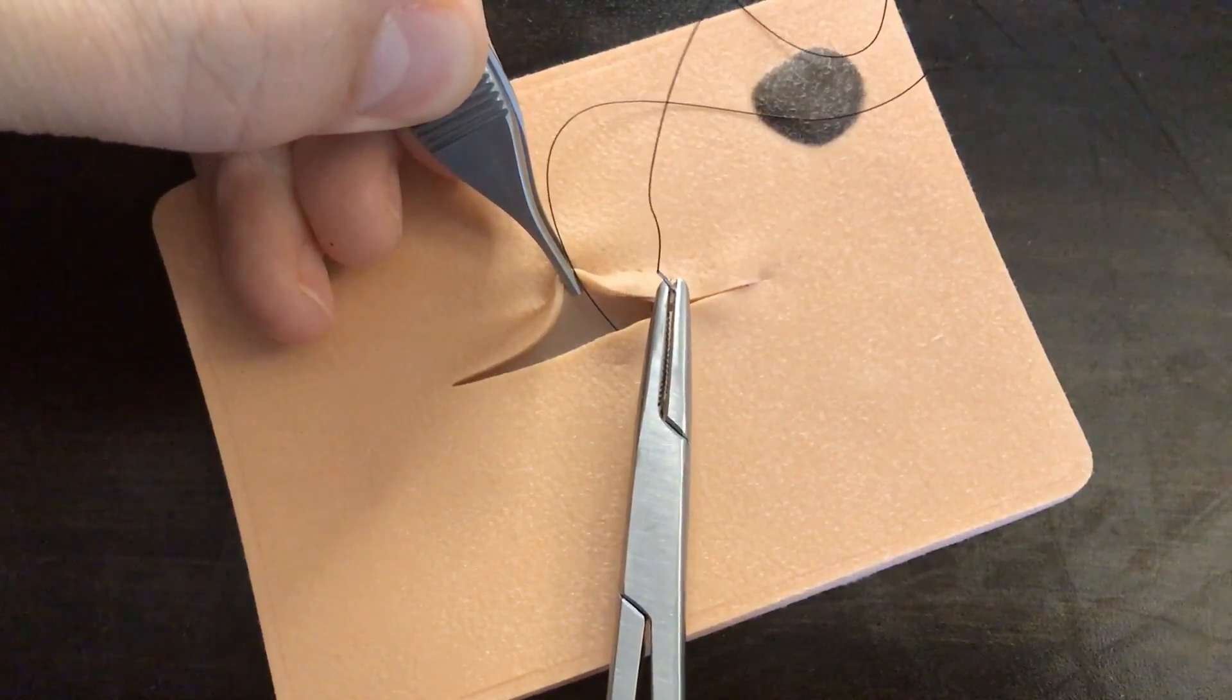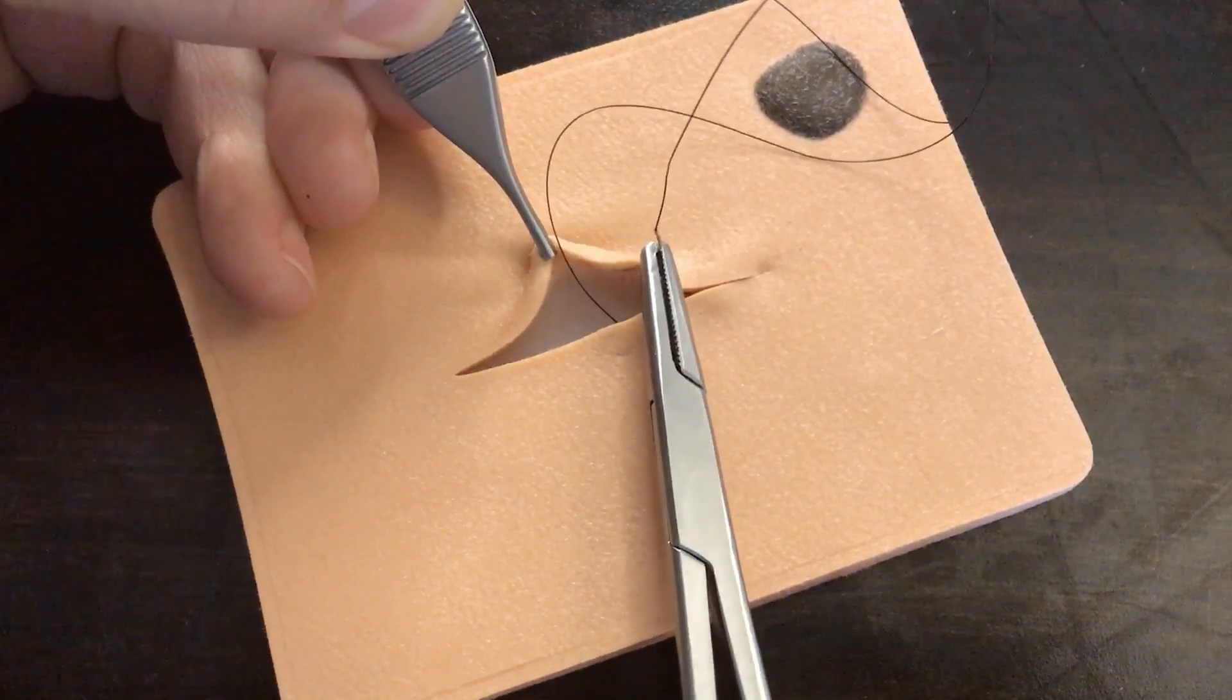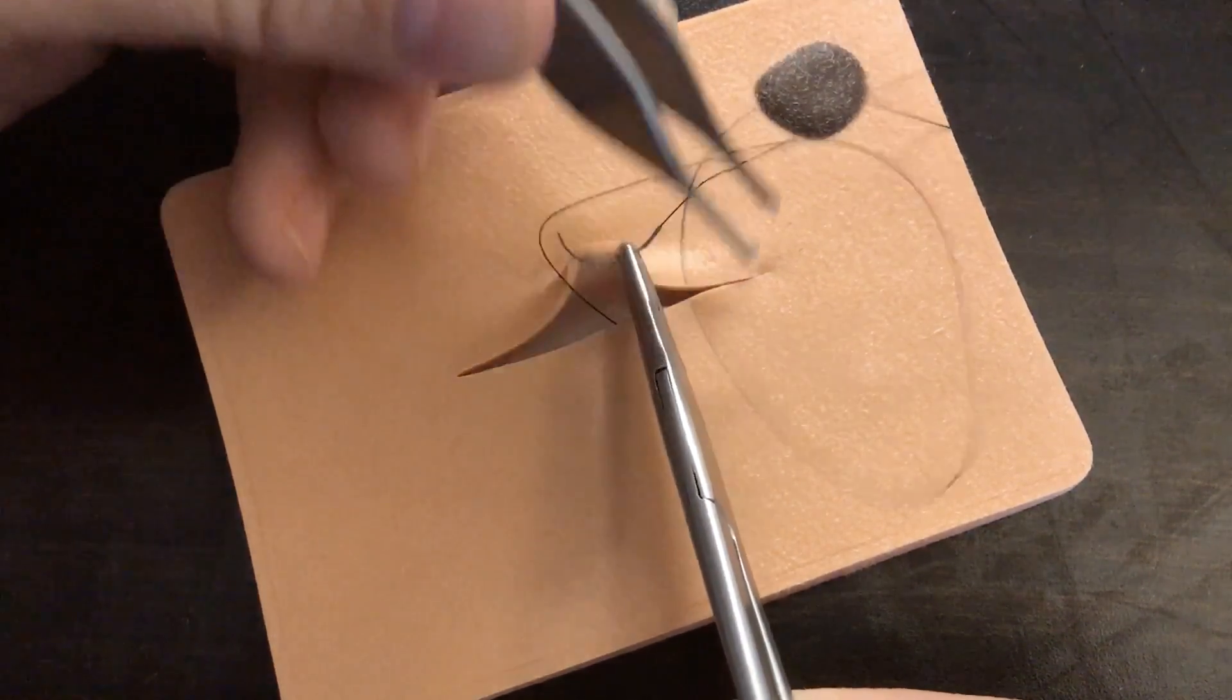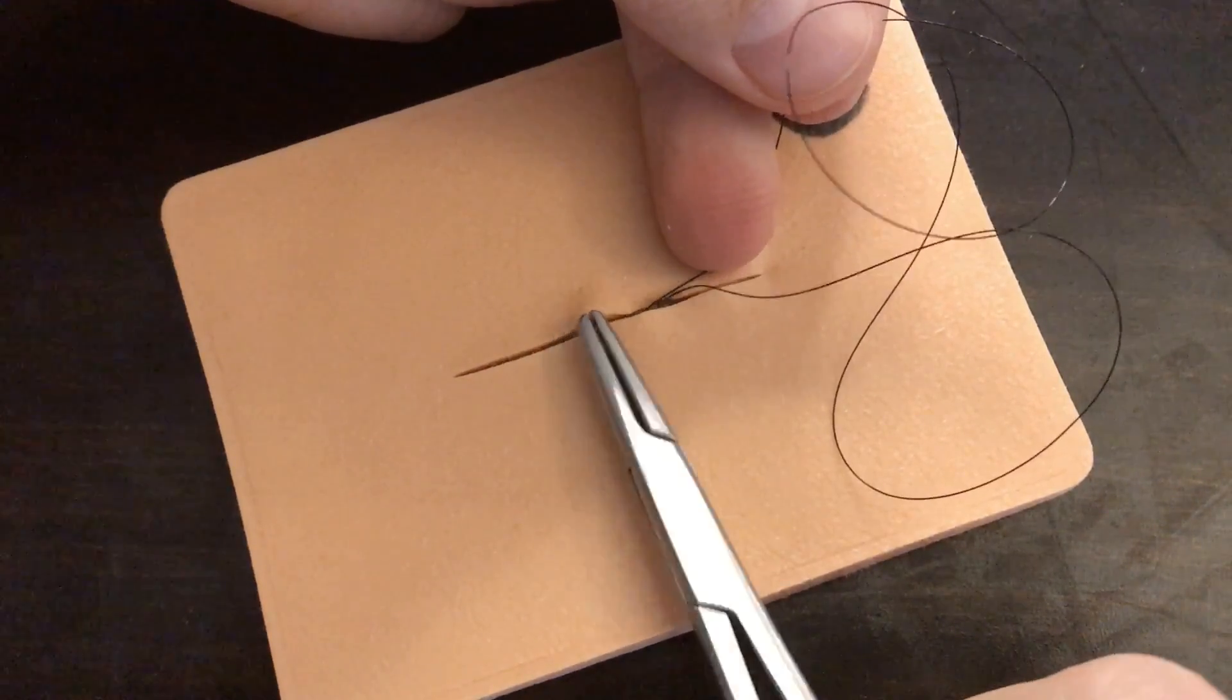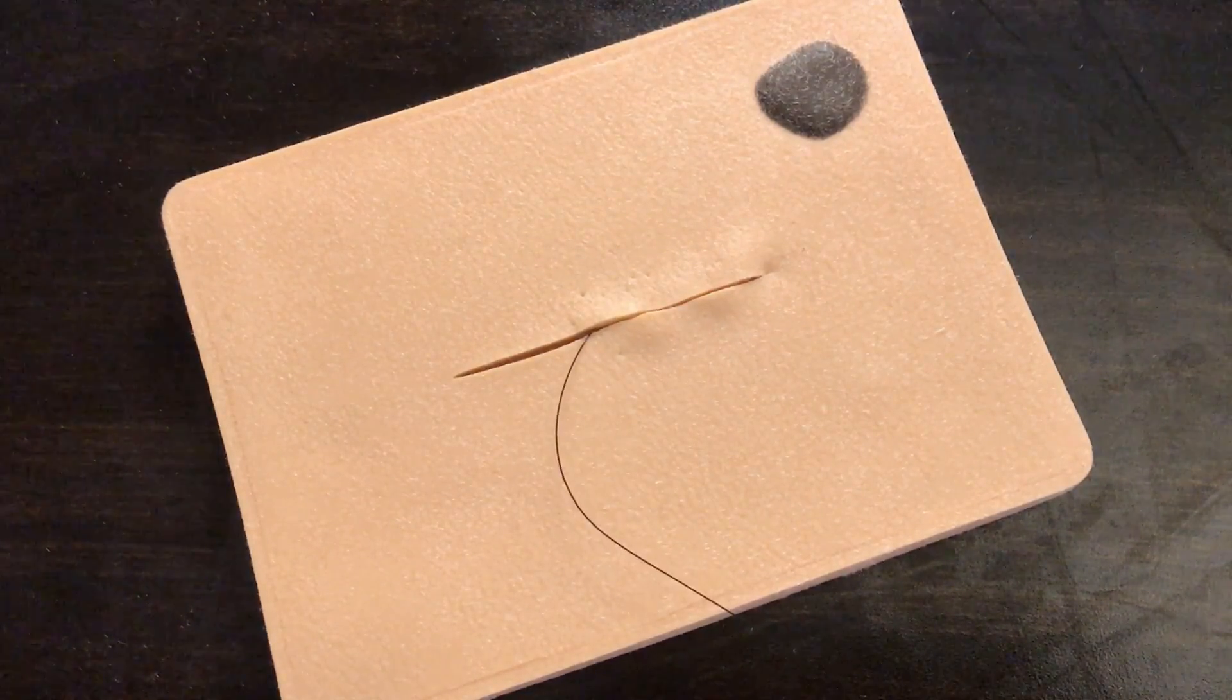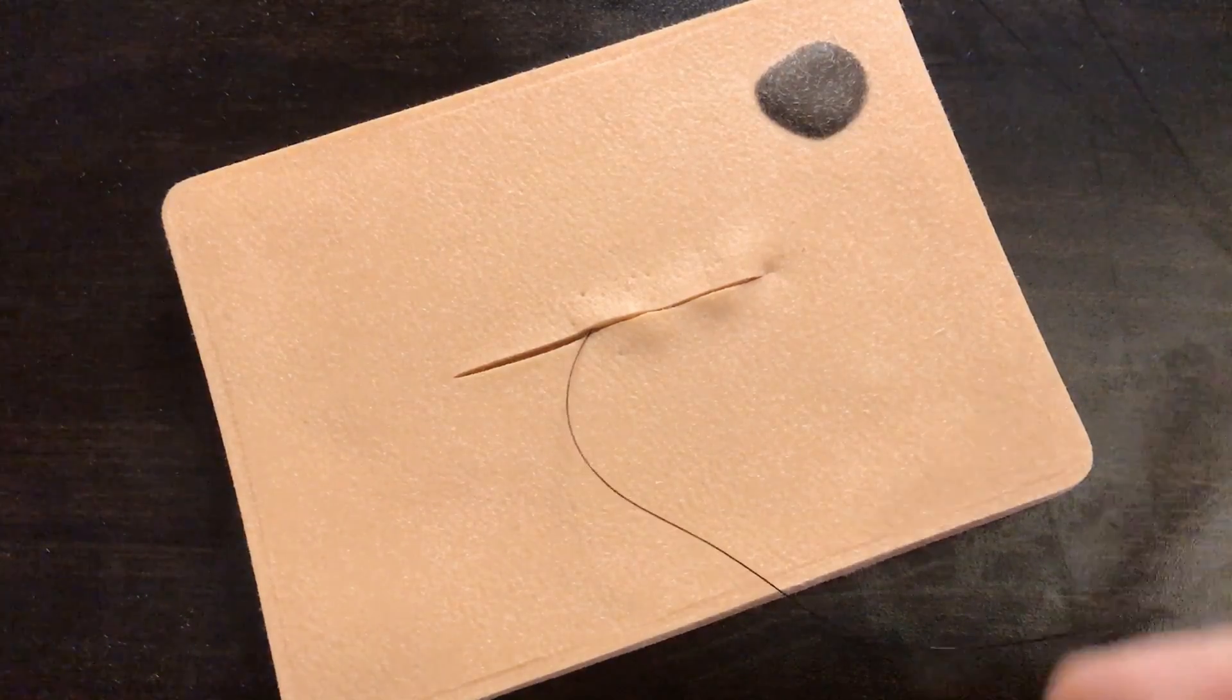So it's a little bit of a time consuming suture, but now when would you want to do a subcuticular suture? That's the good question that's always asked is, when would I choose to do this maybe more difficult, more technical subcuticular suture compared to just doing something like a simple interrupted or a vertical mattress? And that's a great question. The answer to that is you could consider rather doing a subcuticular suture like this anytime there is a big cosmetic concern.